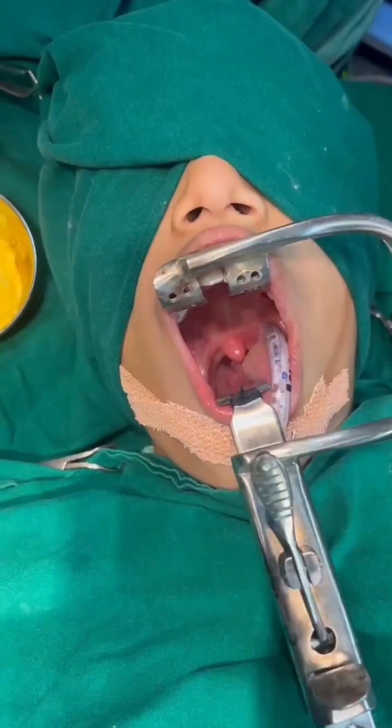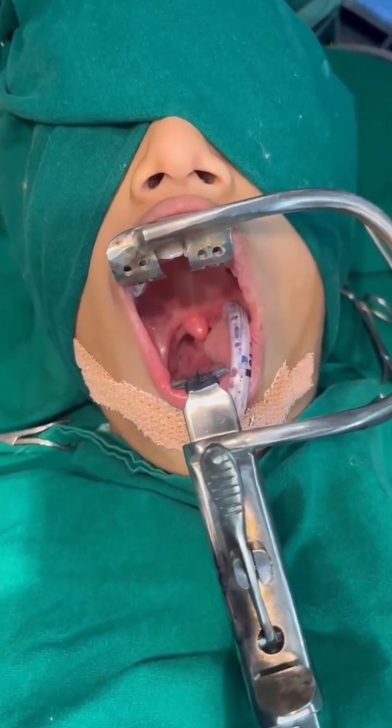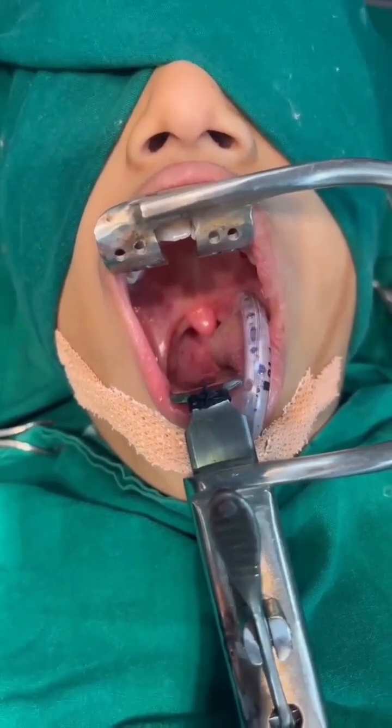We can use a tongue depressor to press the blade. In this case, for demonstration purposes we have used a Boyle Davis mouth gag so we can record in a nice way, as there are hardly any videos on posterior nasal packing.